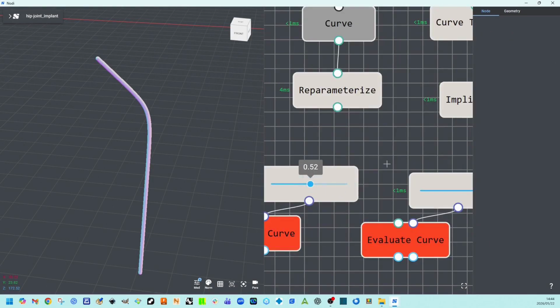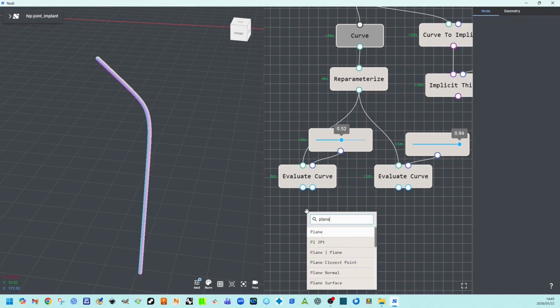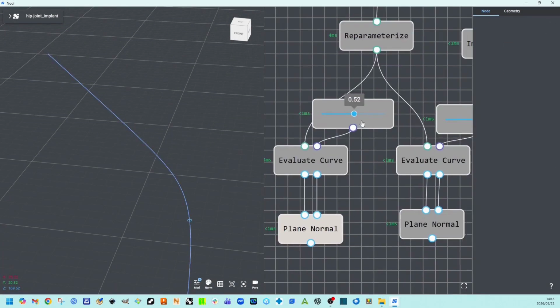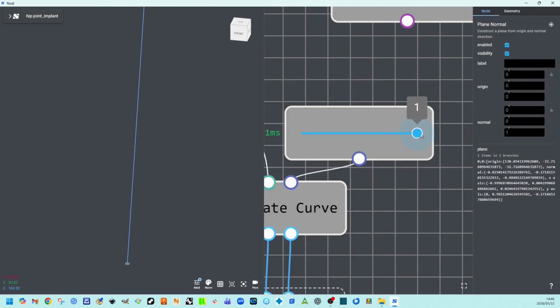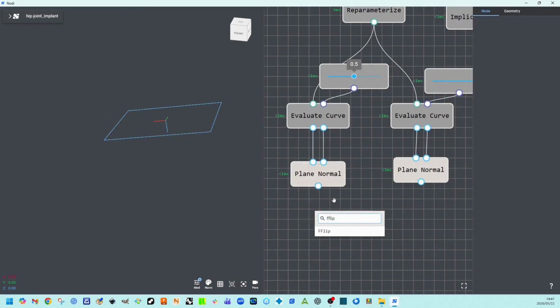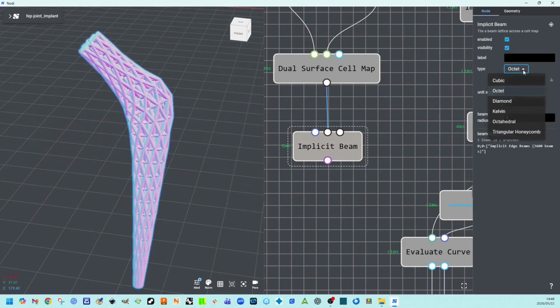To mark where the lattice begins and ends along the stem, we drop 2 Evaluate Curve nodes driven by number sliders at roughly 0.5 and 0.95. Each point feeds a plane normal node, building a plane perpendicular to the curve. These planes will later clip the region where the lattice is applied, so we orient them to face each other.